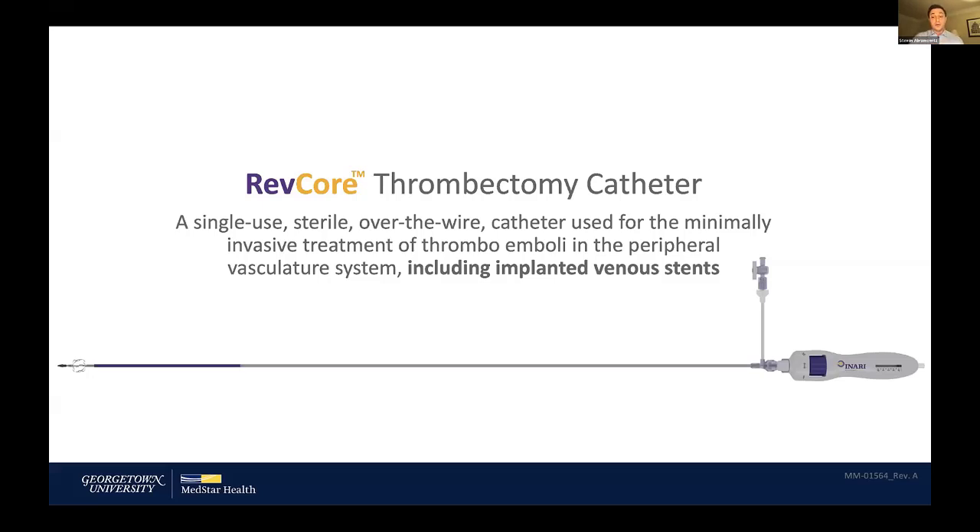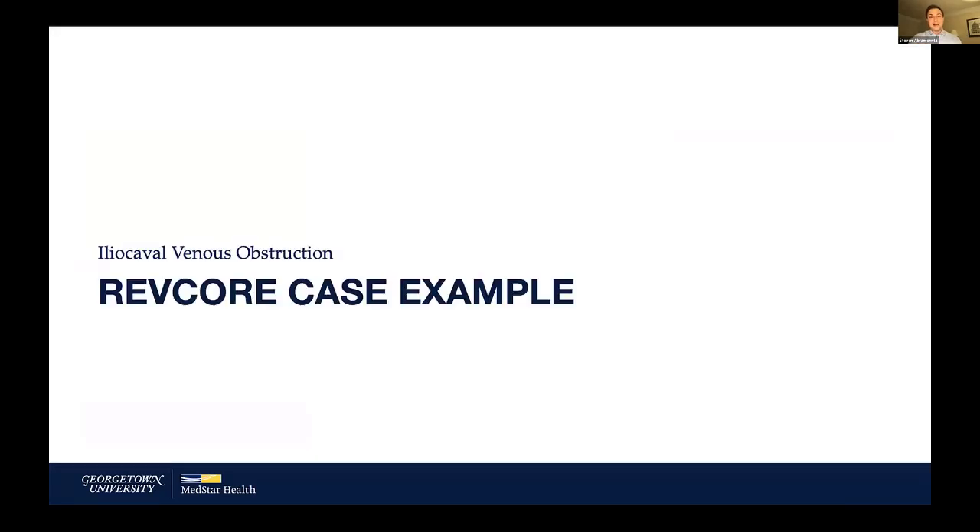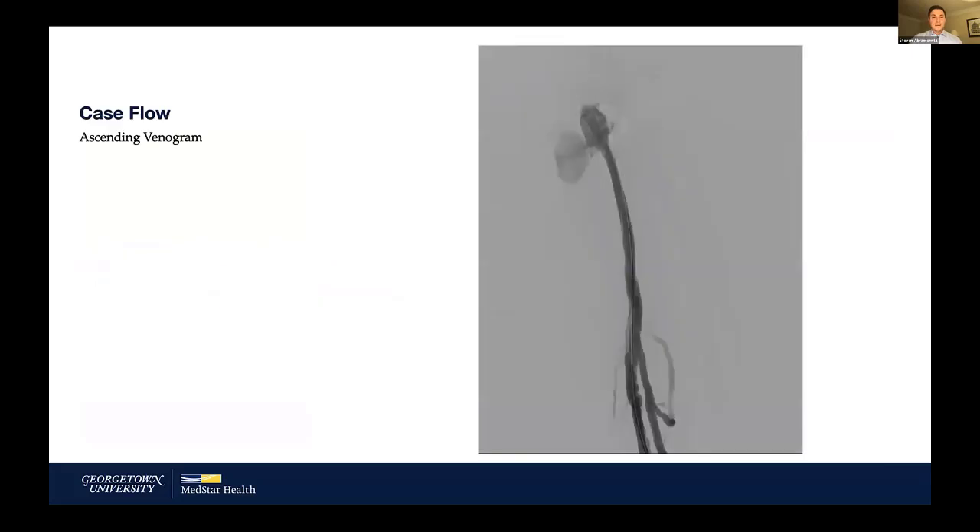I'll show a case where it was applied. One other thing to point out is that it is variable in size — you have a lot of control over how big that coring element becomes, so you can see how it works in the body and how a patient does. We're going to start with a 47-year-old woman whose stent had been known to be occluded for six years, originally placed for a DVT and a May-Thurner lesion.